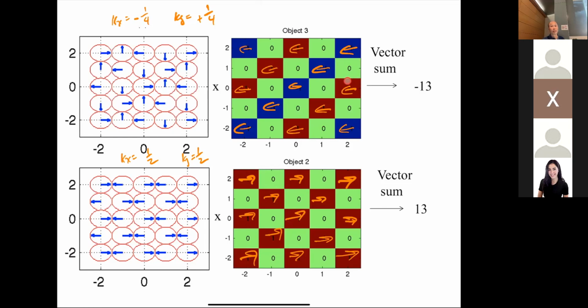It turns out that for most of this course, we're going to talk about phase in terms of a static object. Towards the end of the class, we'll talk about what happens when spins are moving. It turns out you can actually make the phase sensitive to the velocity, right?